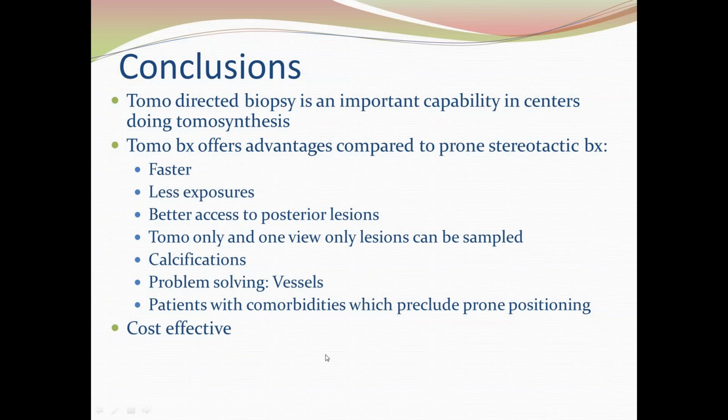So just to conclude, tomosynthesis-directed biopsy is really an important capability in centers doing tomosynthesis, period. So I'm at the point where I would recommend, if you're going to be doing tomosynthesis, and virtually everybody is going to be doing tomosynthesis if they're doing breast imaging, that you fold the biopsy device, which is not that expensive, into the purchase price of the unit.